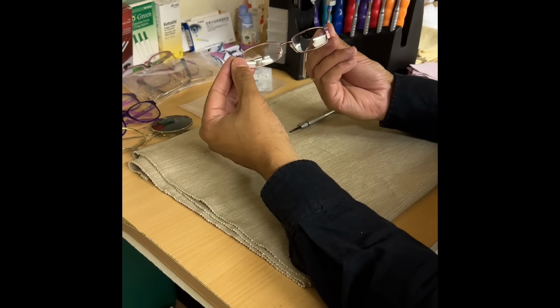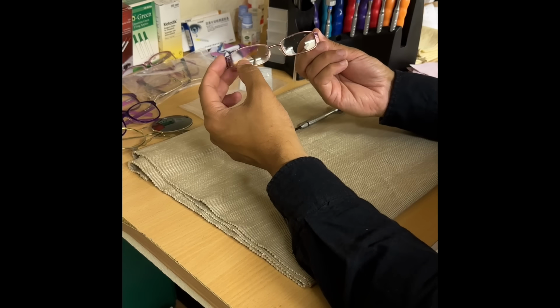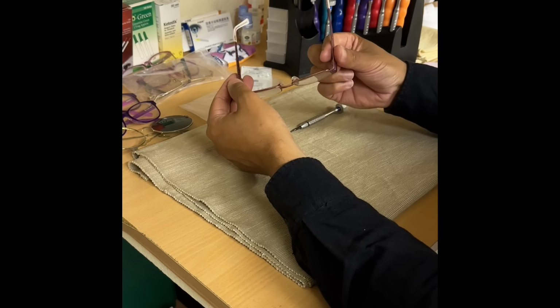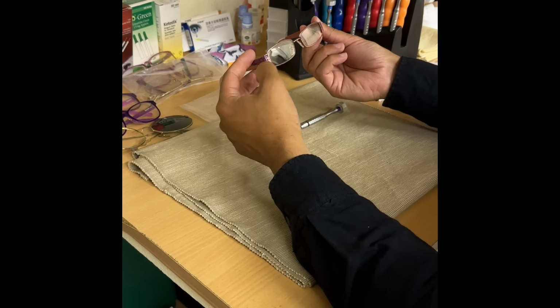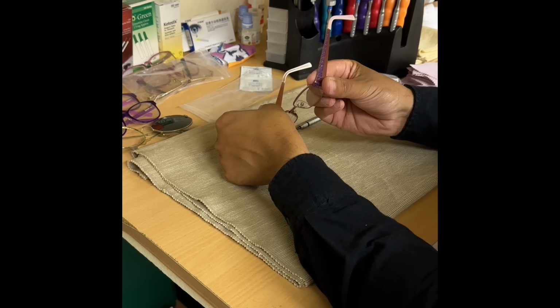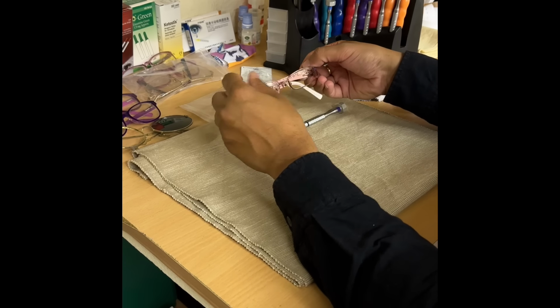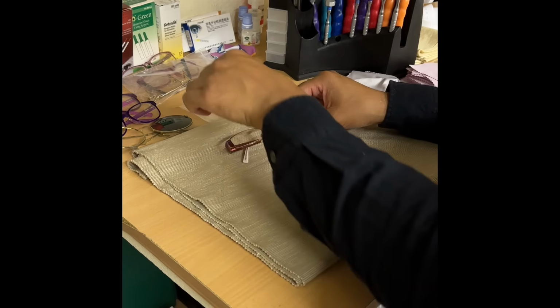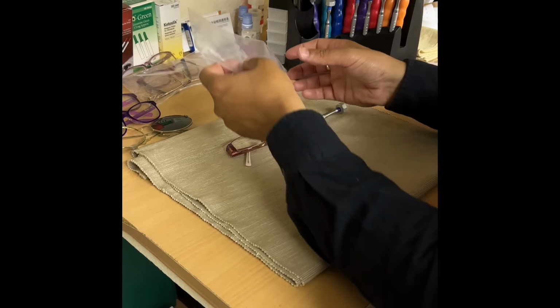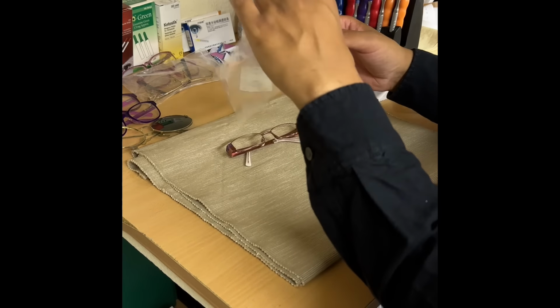So it may be worth changing these lenses, changing the pair. Nothing worse than looking through the scratch there. Otherwise, frame quality is there. So have a little think about just replacing the lenses, please.